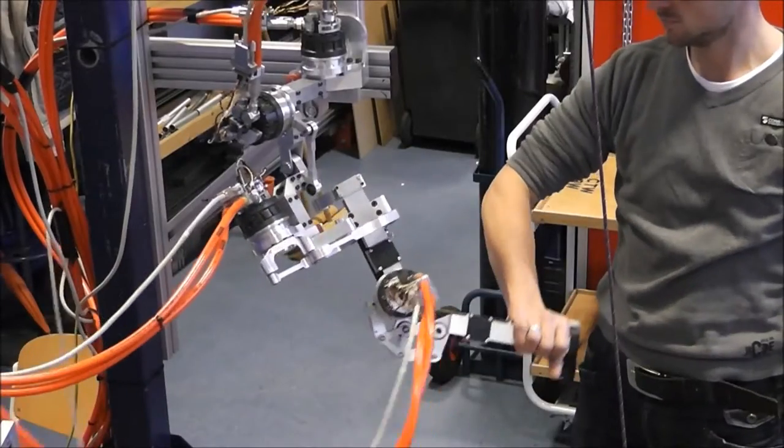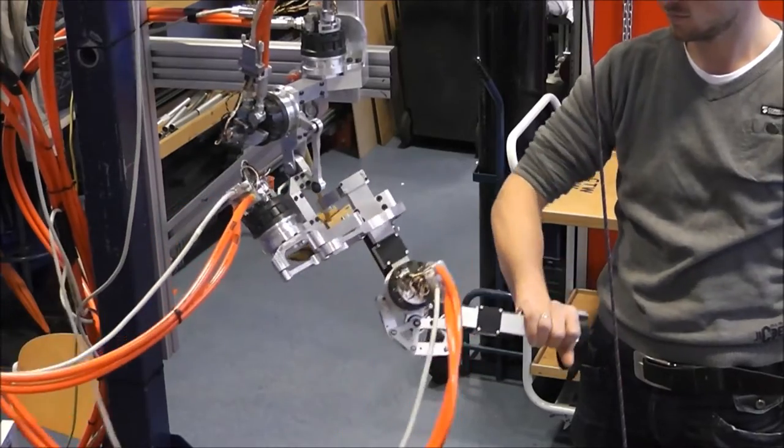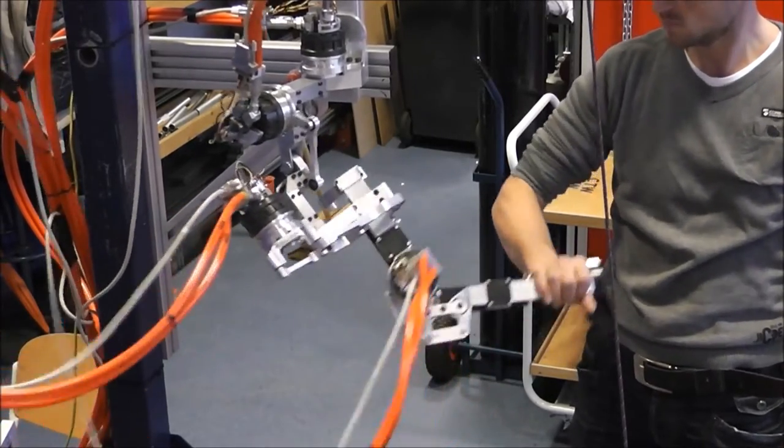The LIMPACT is now in position control mode. The reference is a fixed joint configuration. No instability occurs when the LIMPACT is perturbed.